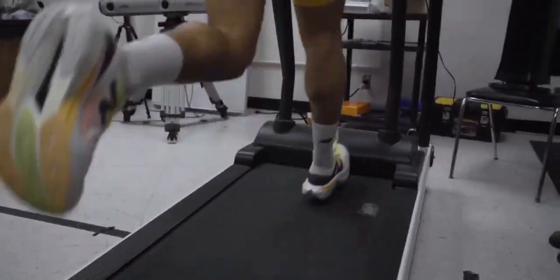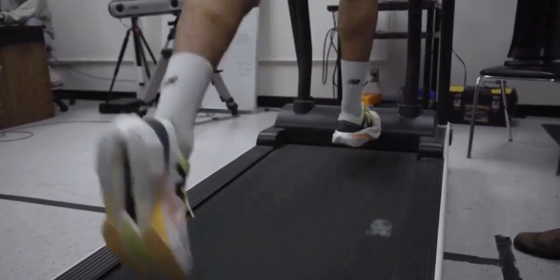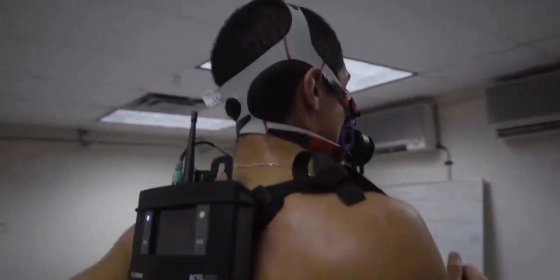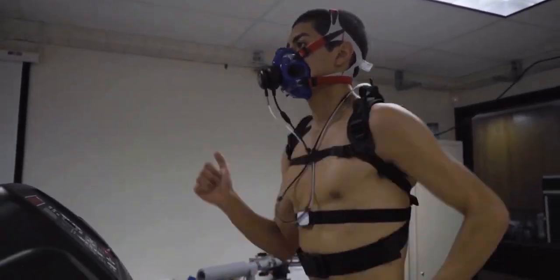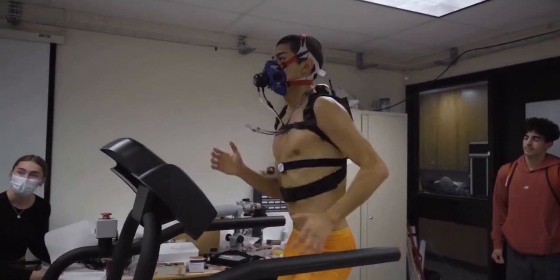Come on Jose, come on, keep it up. Let's go. Come on, you got it. Come up in five seconds. Three, two, one — and up. Let's go, Jose. Come on, 30 seconds left. Let's go. We're up to 4% incline.